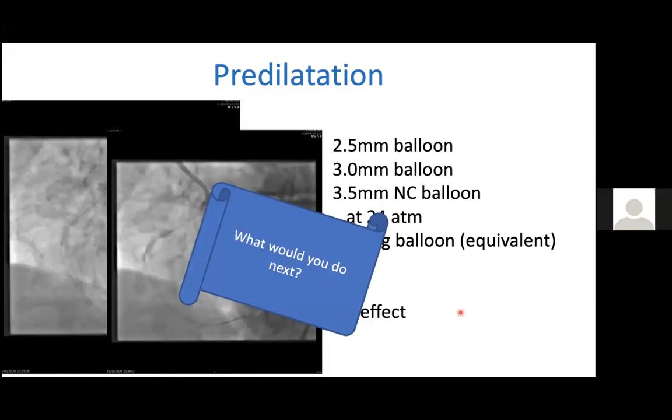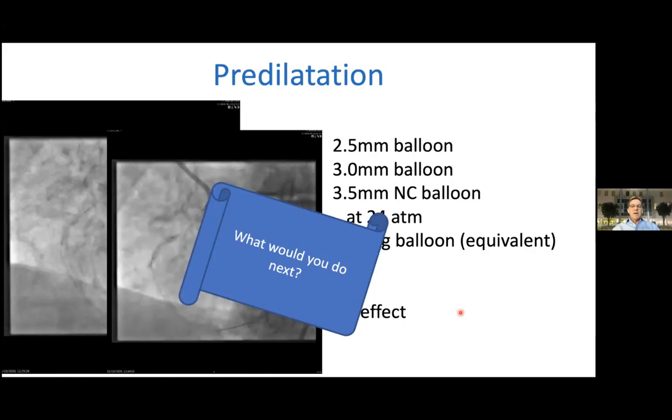So for the coronary, I think you'd have to do atherectomy to get it to yield, and I probably would reschedule the TAVI. Yeah, that's exactly what we thought. You know, you have to stop here and do a complex procedure in the context of severe aortic stenosis, and yeah, we'll come to that later.